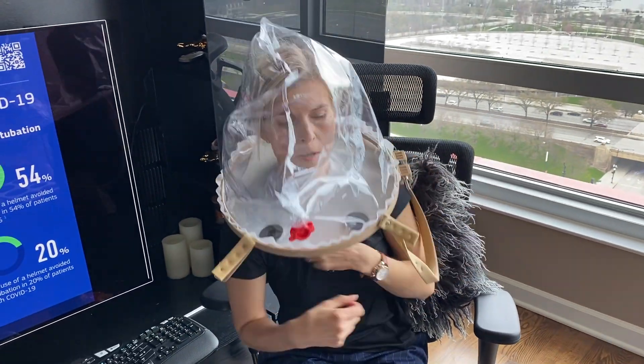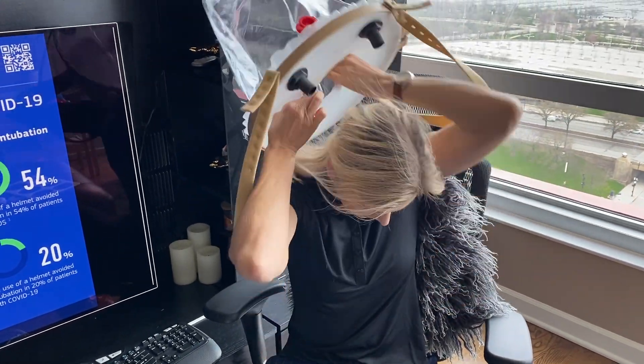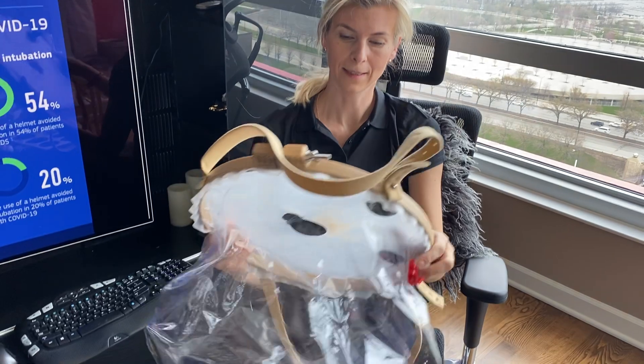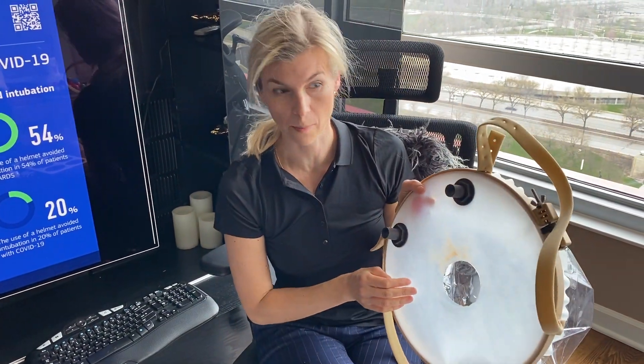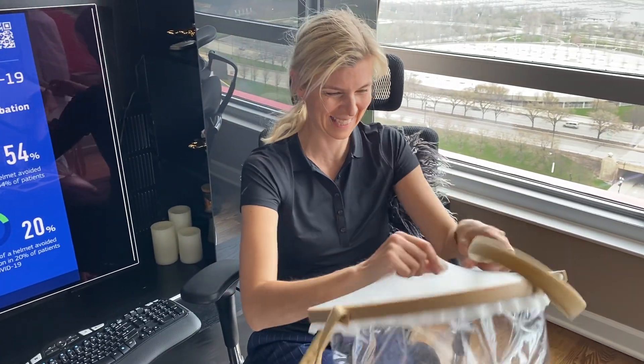Alright, let's take it off. My suggestion: make sure the patient doesn't wear makeup, because as you can see, I have a makeup stain here.